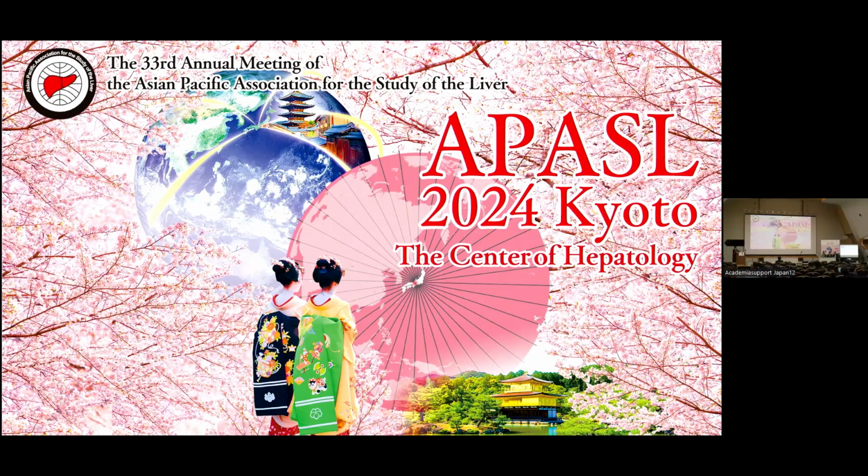For hepatoduodenostomy, could you recommend this procedure to an average skilled doctor, or is it just a rescue for highly experienced doctors? If the right HBD is sufficiently dilated, the procedure itself is safe compared with HGS, because stent migration does not easily occur. As you know, the stomach moves a lot, but the duodenum is very close to the hepatic parenchyma. Therefore, US-HDS is not so difficult compared with HGS. Endoscopists who are trained in EUS-FNA and EUS-GBD can, I think, perform HDS safely.